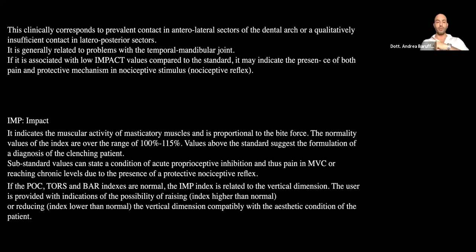And the contrary, if we have a low index about the impact, and we decrease the vertical dimension, usually the impact increases.